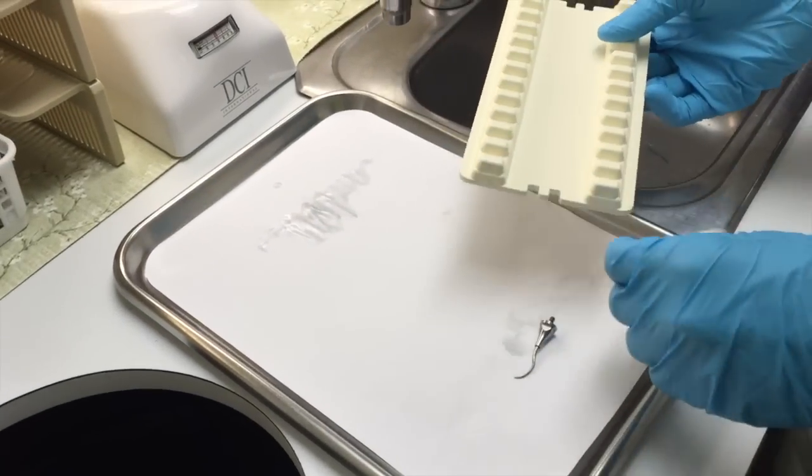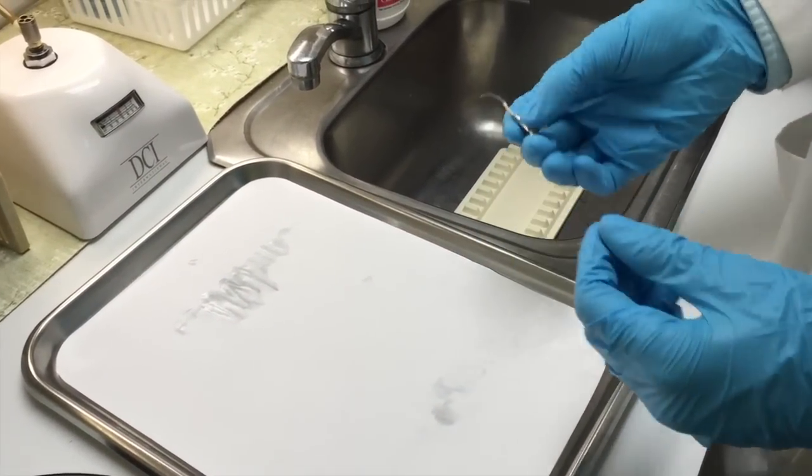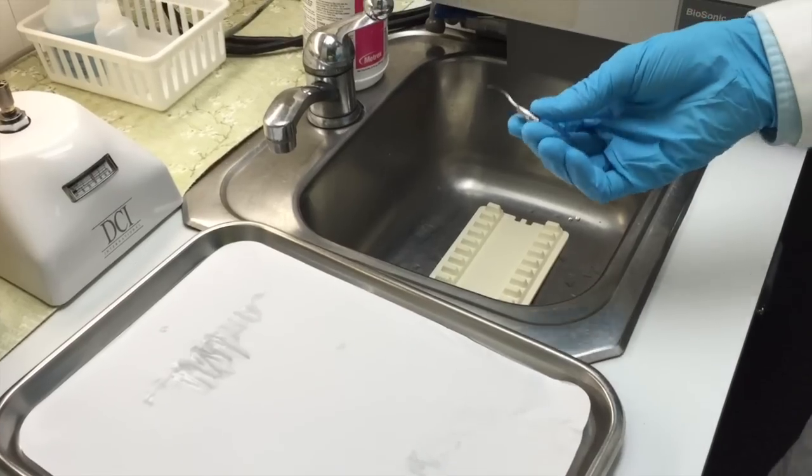While the instruments are running through the ultrasonic cleaner, we're going to take care of the rest of the tray. First thing we're going to do is take the instrument tray and put it in the sink, as well as the scaling tip, which we couldn't run through the ultrasonic cleaner due to its size.